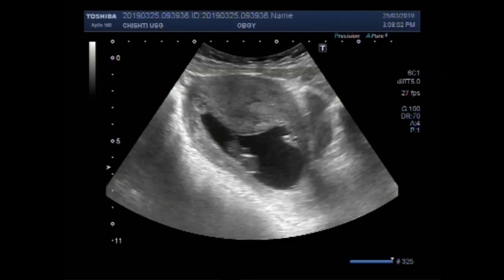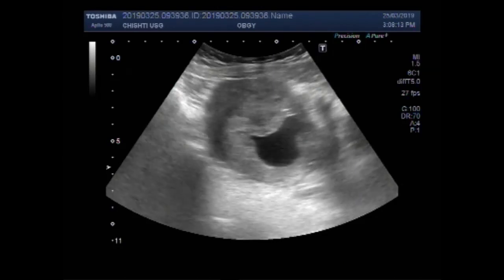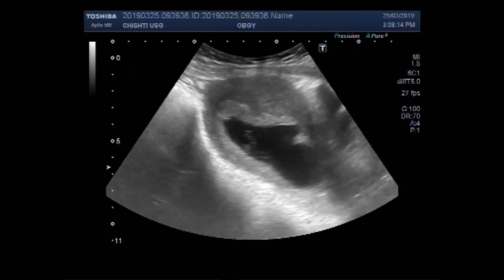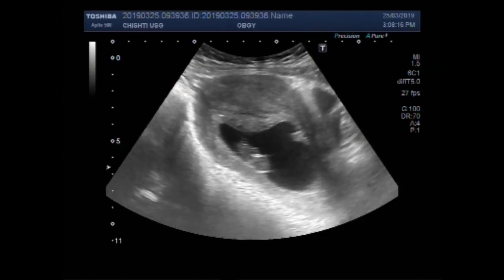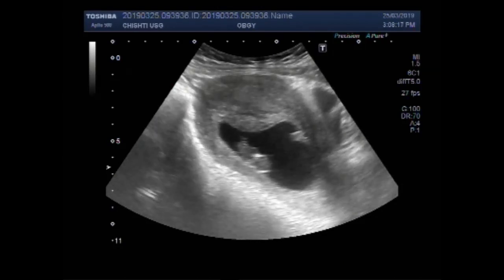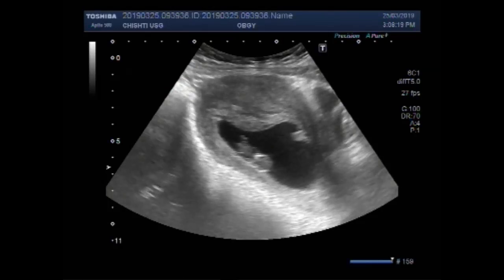You can see a small fetus. This is the placenta. This is the small fetus. No cardiac activity and no blood flow is seen inside the fetus.